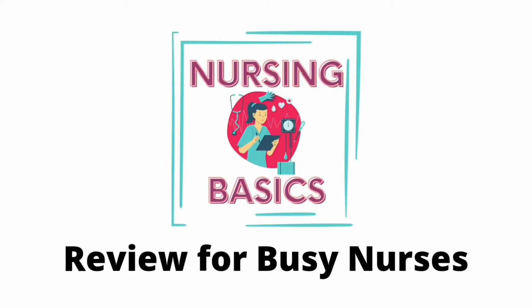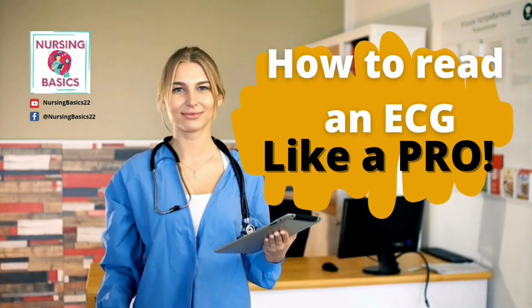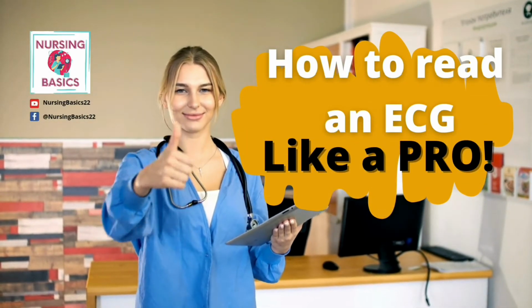Hello. Welcome to Nursing Basics Review for Busy Nurses. For this session, we will study how to read a basic ECG strip, like a pro.